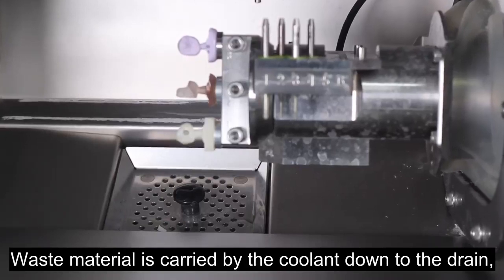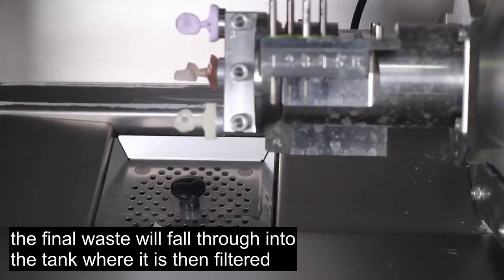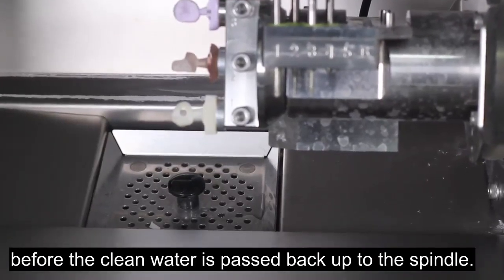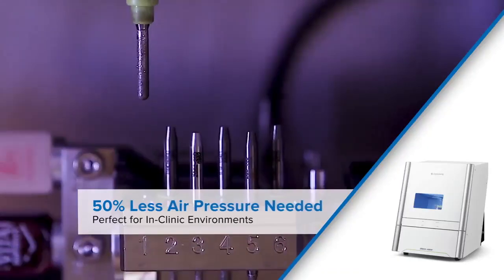Waste material is carried by the coolant down to the drain. The finer waste will fall through into the tank but is then filtered before the clean water is passed back up to the spindle. One of the innovations we have introduced has allowed us to reduce the level of compressed air required to drive the wet mill.